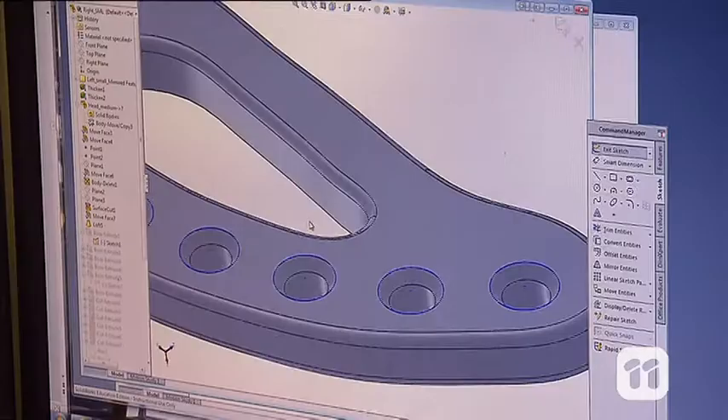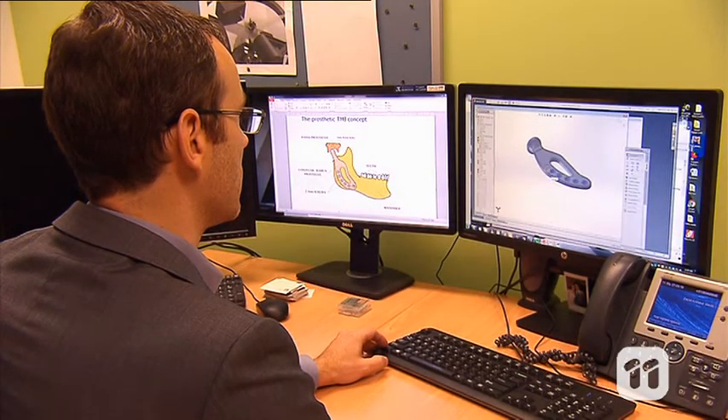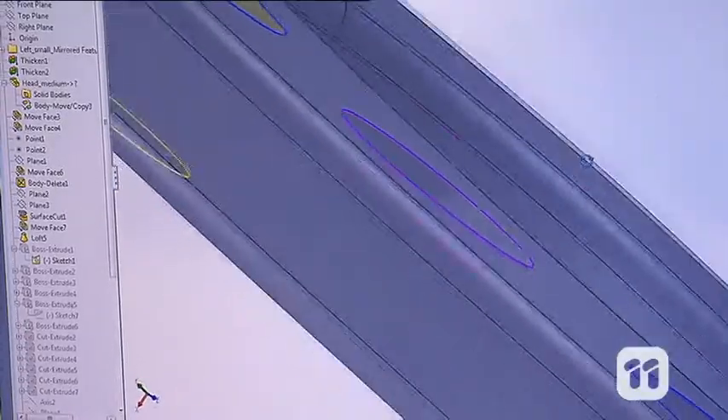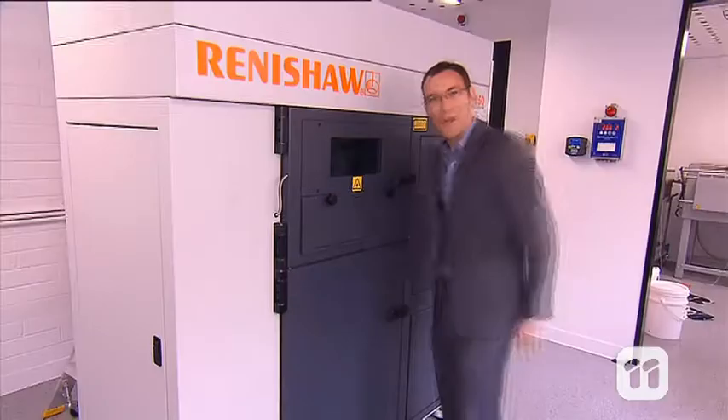To create an artificial jaw implant we first need to scan the patient's jaw with medical imaging. From these scans we can use computer aided design to model an implant that would fit into the patient. The design is then sent to a 3D printer for fabrication. This is a 3D metal printer — it fuses titanium in layers to create a 3D part. And here's the finished product.